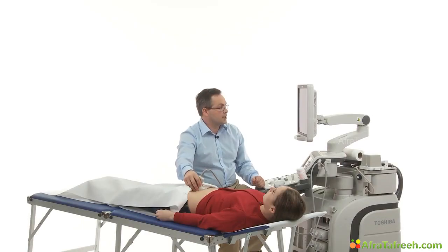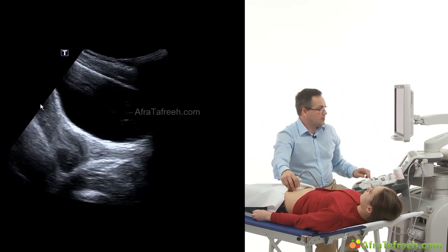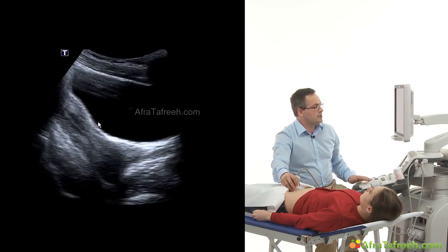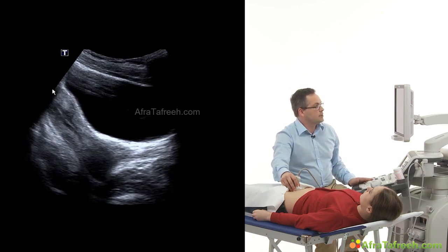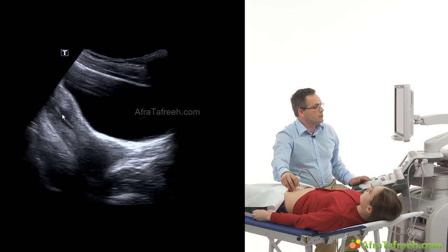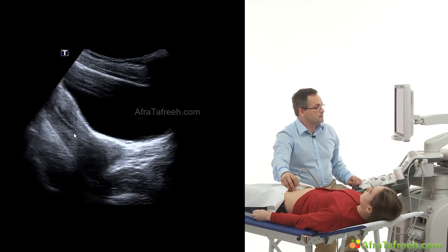So we're going to scan another female patient. In the longitudinal view, we see the bladder, dorsal to the bladder, the vagina, and here we can see the uterus with cervix uteri, which is located near to the vagina, and the most cranial part of the uterus, fundus uteri. And in between we can see the body of the uterus. We can easily detect the muscle layer and the outline of the uterus and the inner portion with the endometrium and the bright echo in between here.